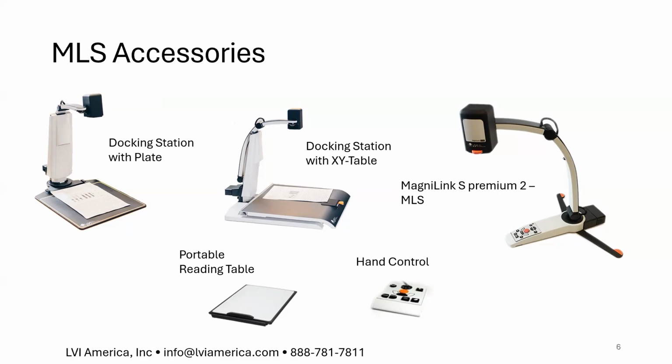The next picture on the top right shows the MagniLink S all up by itself with the legs back. I always say it's a really good cheerleader. It can do the full splits, and that's how the legs should be. They should be all the way back. Then you have a hand control. The bottom hand control, you get this hand control when you purchase a docking station because how the actual MLS camera fits in the docking station, the controller that's on the unit itself is covered up.